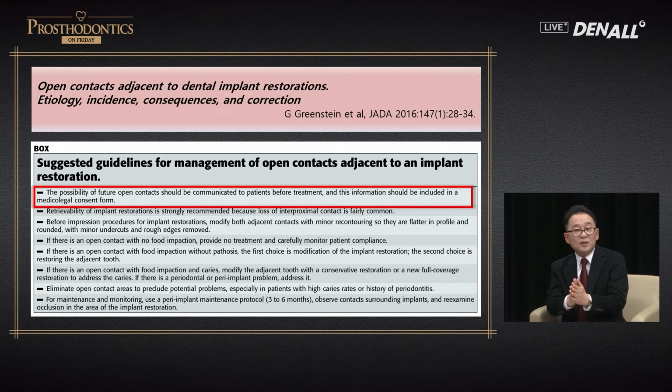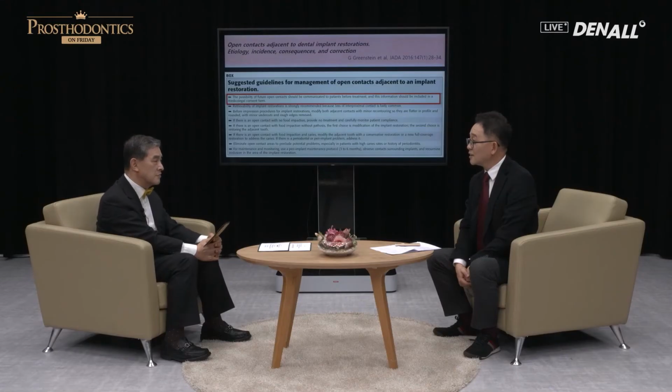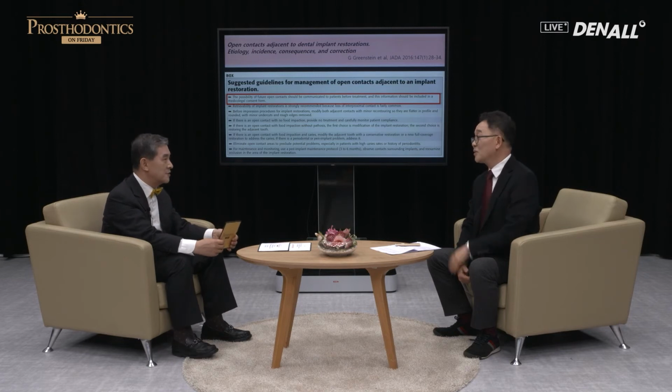Let me introduce an episode. I wrote a paper regarding the prosthesis and sent it to a journal in a Western country, and the reviewer said it is not a problem when it comes to an implant. So I was baffled. I thought that this is a problem confined to Koreans, mesial drifting leading to food impaction.